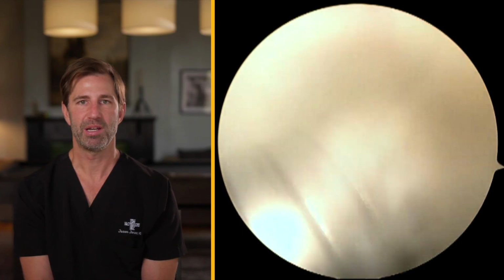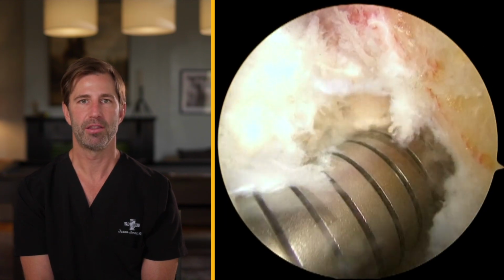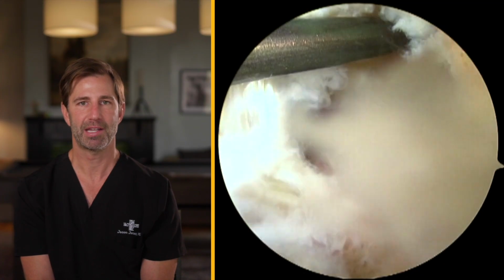At this portion, we're reaming a bone tunnel. What this means is we're removing bone in a 10 millimeter diameter to allow the new ACL to sit within the upper portion of the knee. This will be held into place by a metal screw at the end of the case.